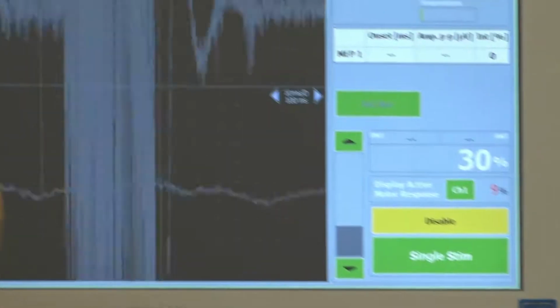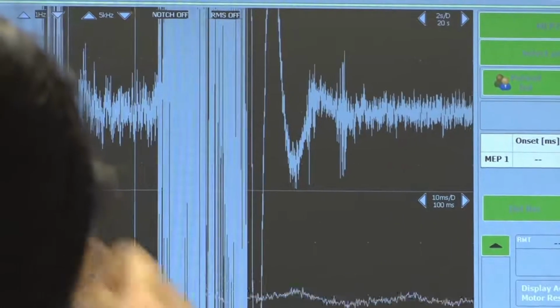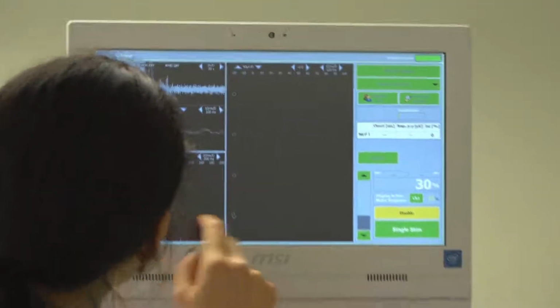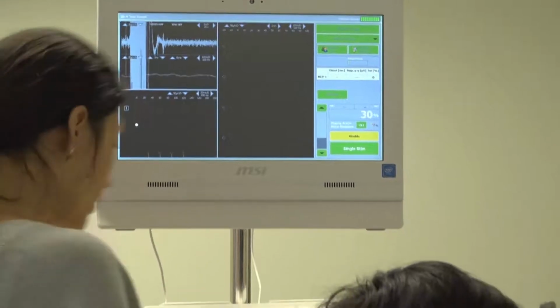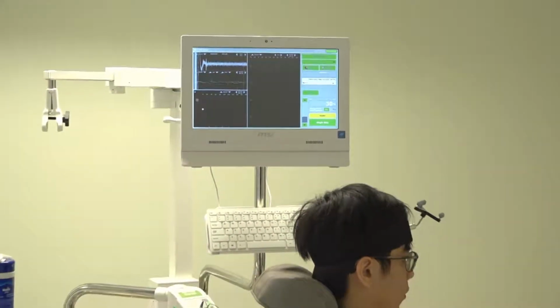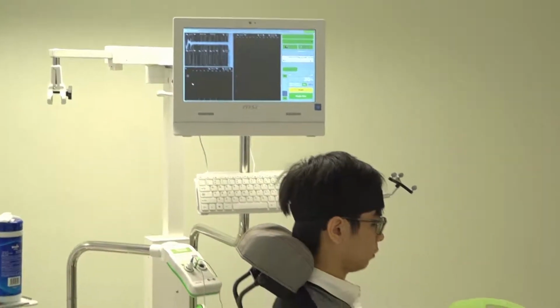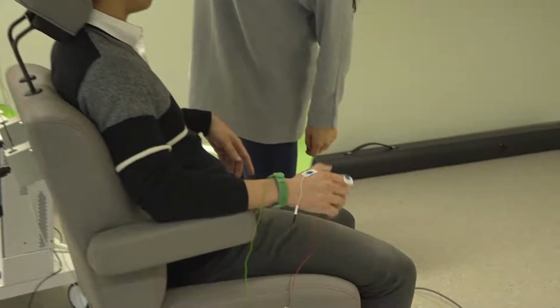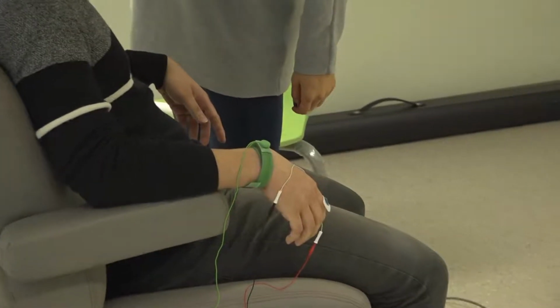And I'm going to use relax. Relax the hands. Can you do a fist? So we have the signal here. Relax. Relax, relax, relax.